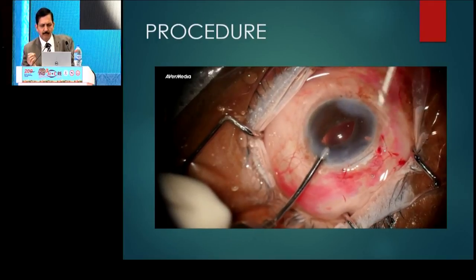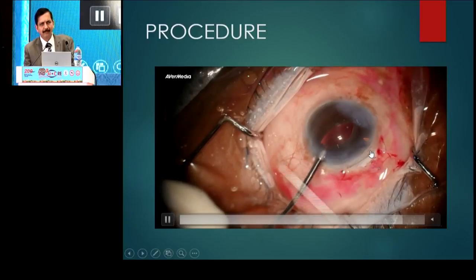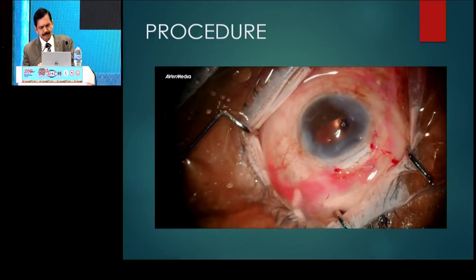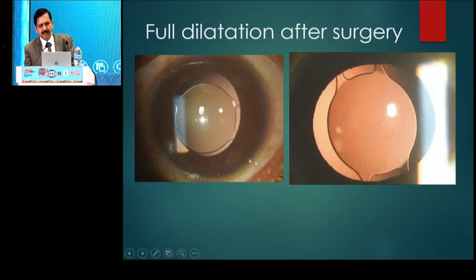Once it is done, push the optic behind and it is advisable to do a peripheral iridectomy — this can be done with the vitrector itself. The pupil can dilate up to 8 millimeters almost, so posterior segment examination and management of posterior segment problems is not a problem at all.